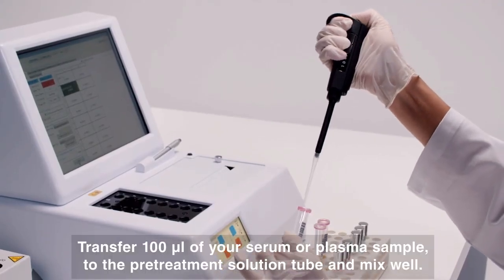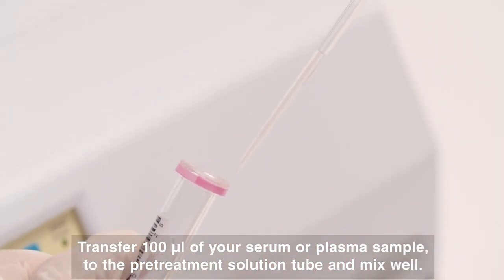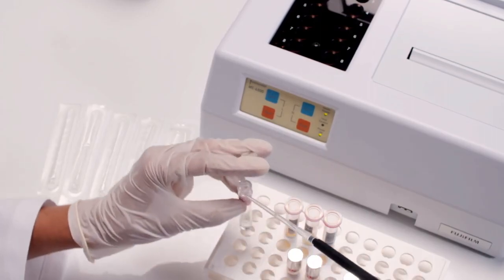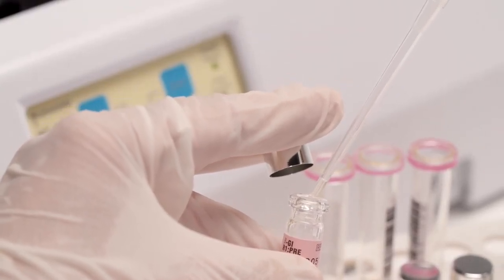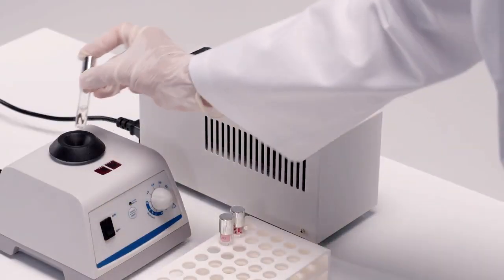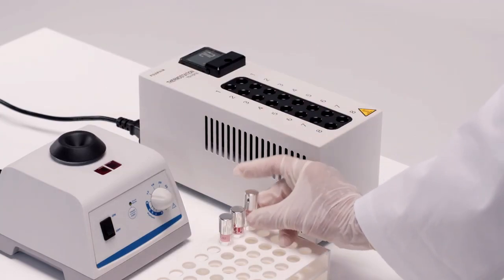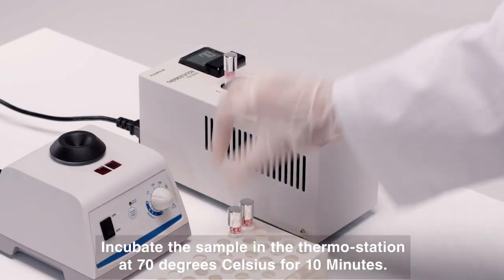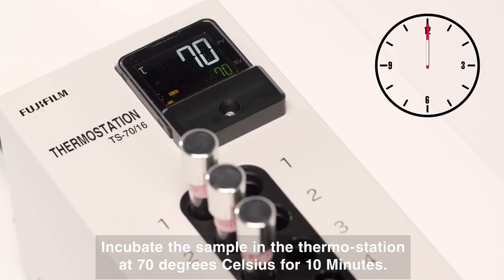Transfer 100 microliters of your serum or plasma sample to the pre-treatment solution tube and mix well. Incubate the sample in the thermostation at 70 degrees Celsius for 10 minutes.